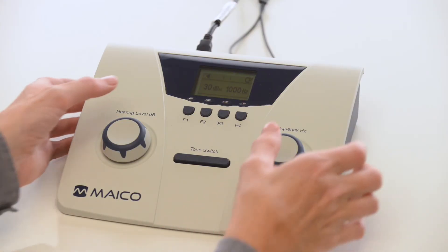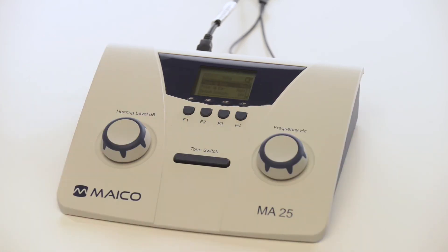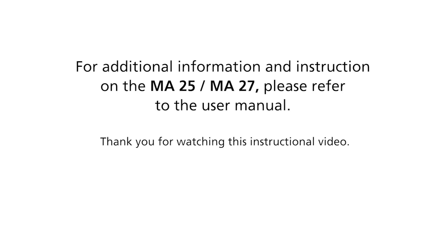To access the settings menu, press F1 and F4 simultaneously. For example, start intensities and frequencies can be adjusted to allow for faster testing times.